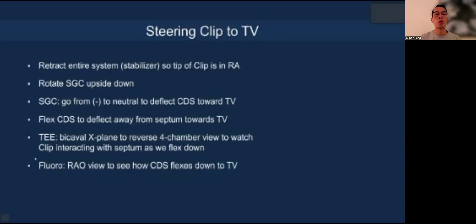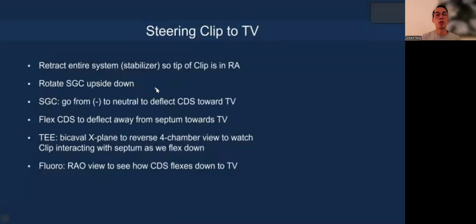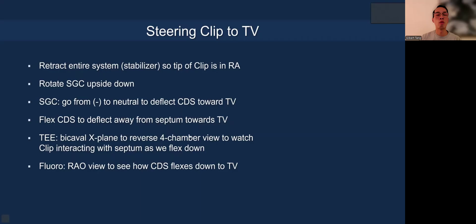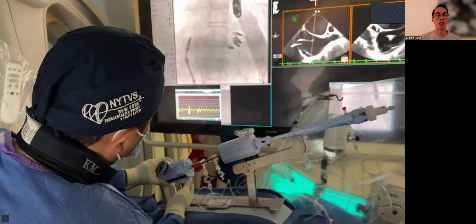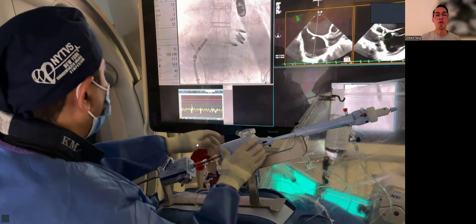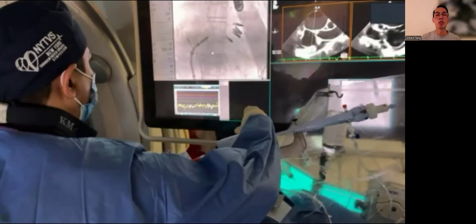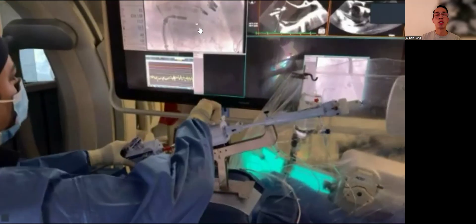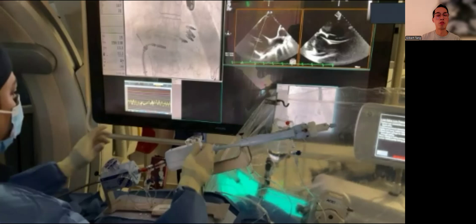When we steer the clip to the tricuspid valve, we retract the entire system so the tip of the clip is in the RA. We rotate the guide, going from a negative position to neutral to deflect the CDS towards the tricuspid valve, and use the IFlex to deflect away from the septum towards the tricuspid annulus. This is done on echo using the bicaval X-plane to reverse four-chamber view, watching the clip to avoid septal interaction, while fluoroscopy is simultaneously used to see how it flexes down towards the tricuspid annulus.